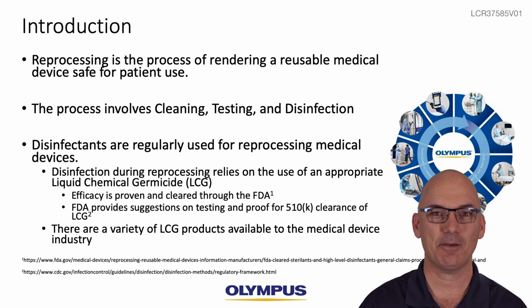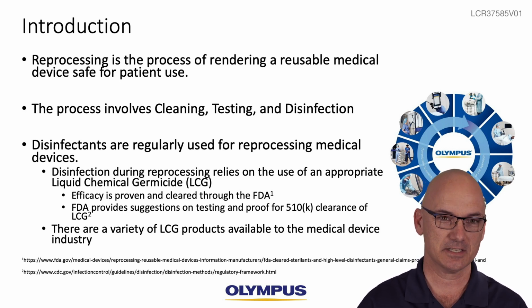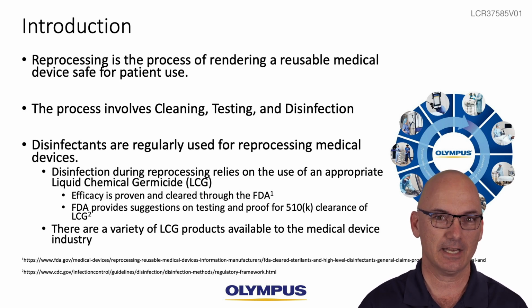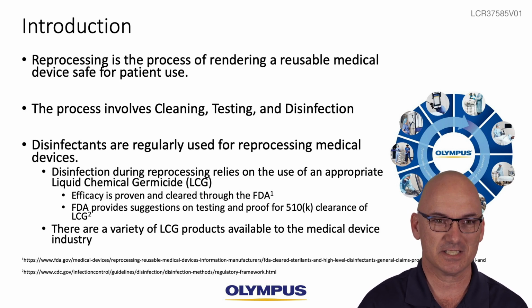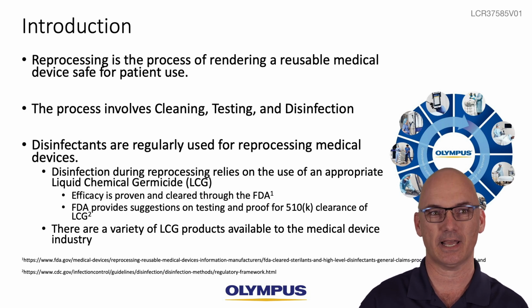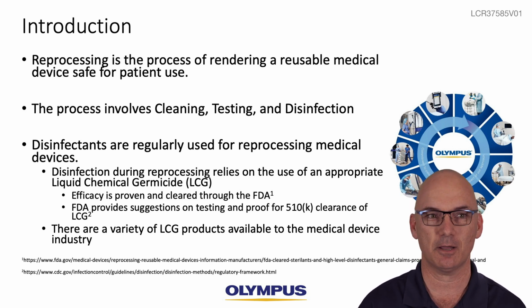Thanks, Mindy. I would be happy to go through reprocessing solutions at a high level. I think it's important to set the ground rules here and the foundation. Any reusable device needs to be reprocessed before being used on another patient. And reprocessing is the process of rendering a reusable medical device safe for that next patient. This includes cleaning, testing, disinfection, among other steps.